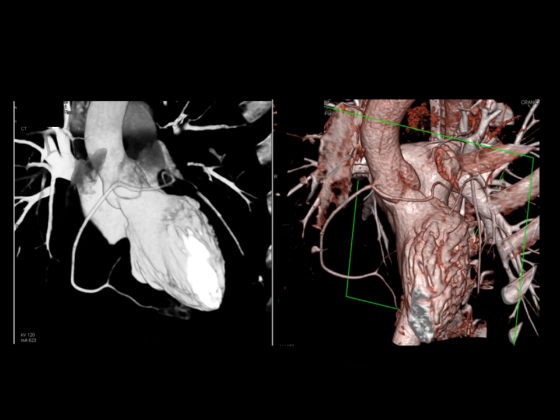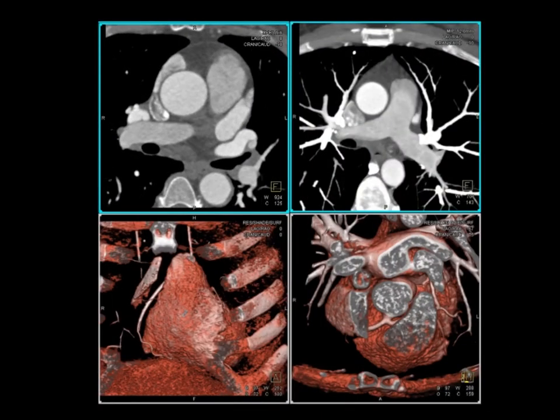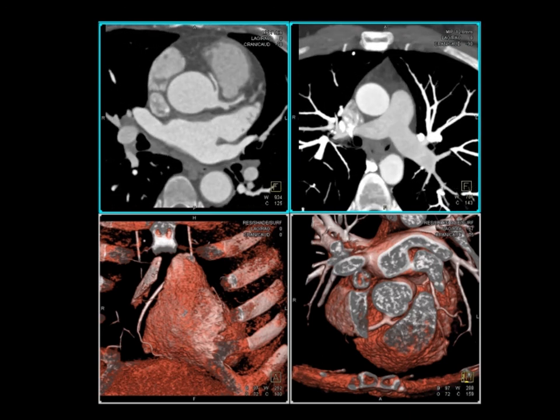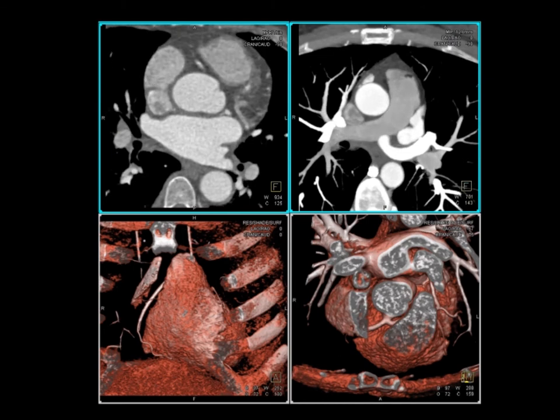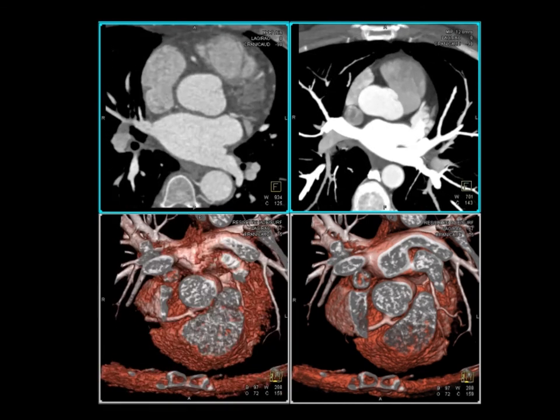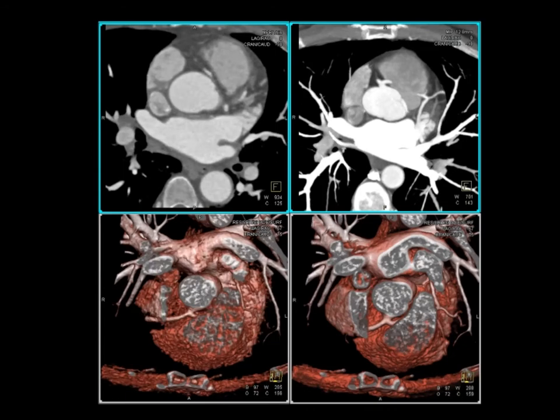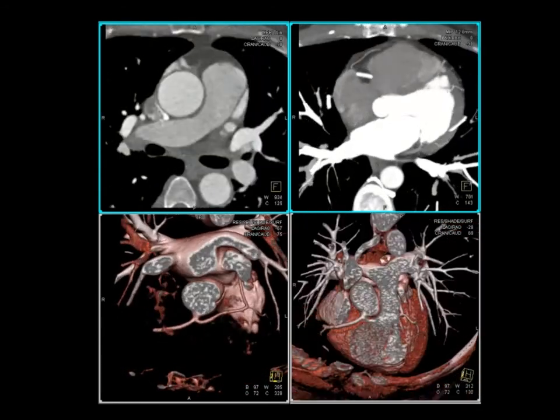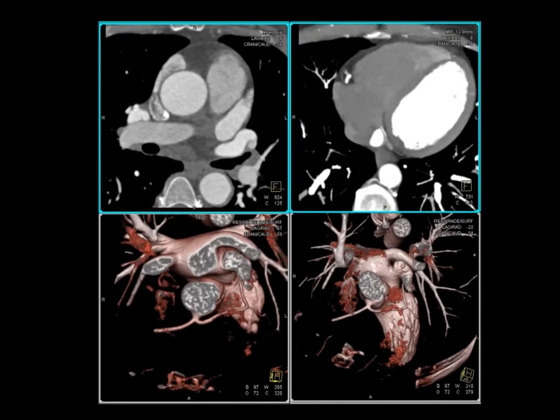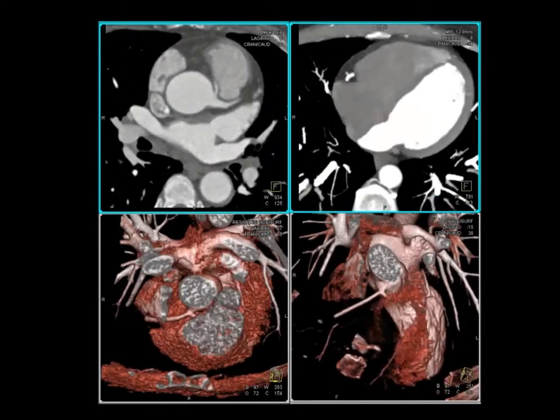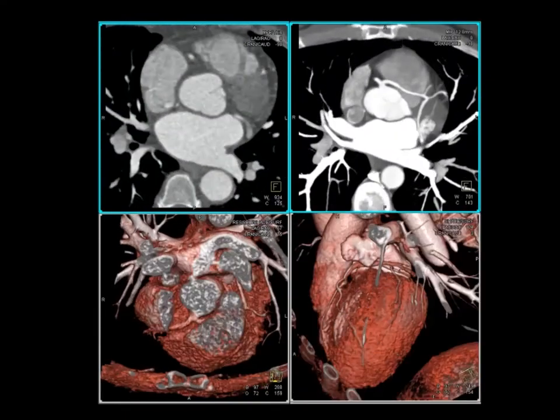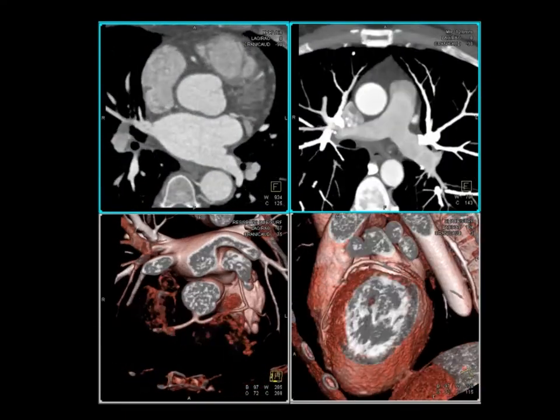You can look at that and see it in 3D as well. Looking at it in motion, you can follow it down and see — as you follow the images — the patient's origin of the right main coronary, then the right coronary itself, and then another vessel which is the left. You can see that in 2D, rotate it in 3D views particularly from above, and see it with motion. A very nice example of the single vessel bifurcating.